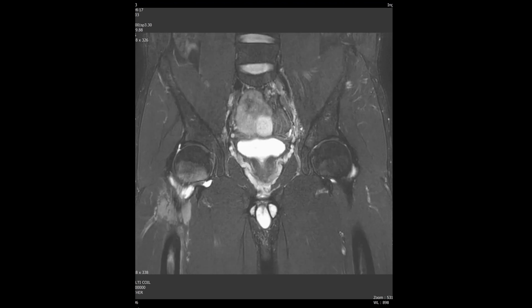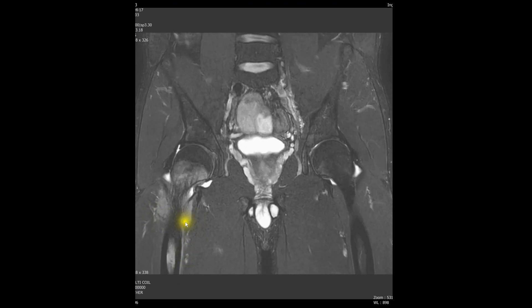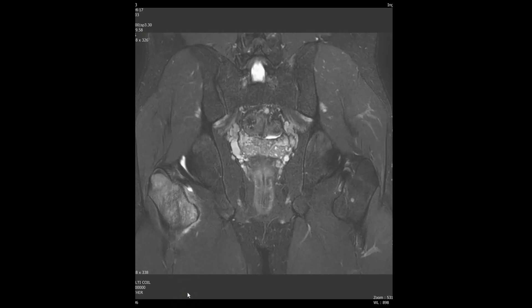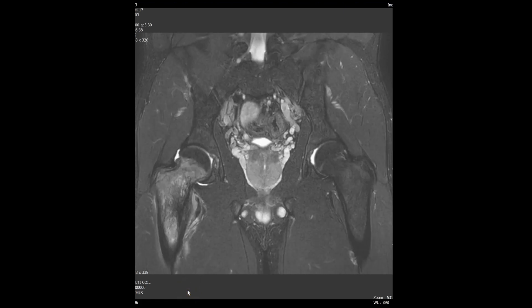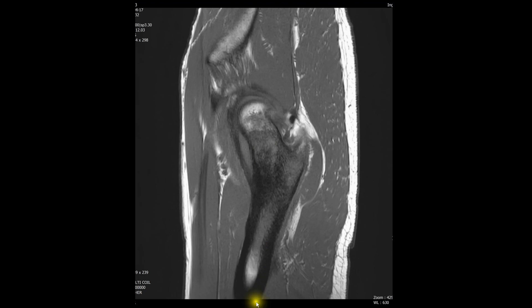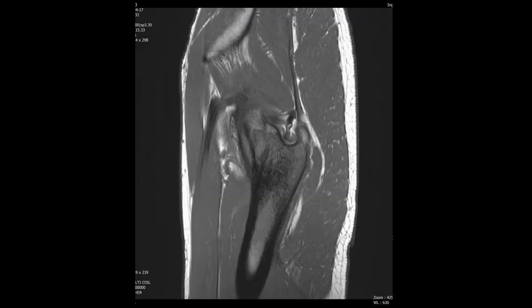A symmetric, wing-like soft tissue mass is noted anterior to the bone surface at the medial aspect of the lesser trochanter, with clear evidence of transperiosteal tumor spreading into the adjacent soft tissue. The tumor measures 119 mm in longitudinal length and 61 mm in transverse width. Oblique T1-weighted imaging along the femoral neck axis demonstrates diffuse low-signal-intensity infiltration within the bone marrow cavity, measuring approximately 114 mm in longitudinal diameter, with joint effusion in the inferior recess and cortical irregularity.